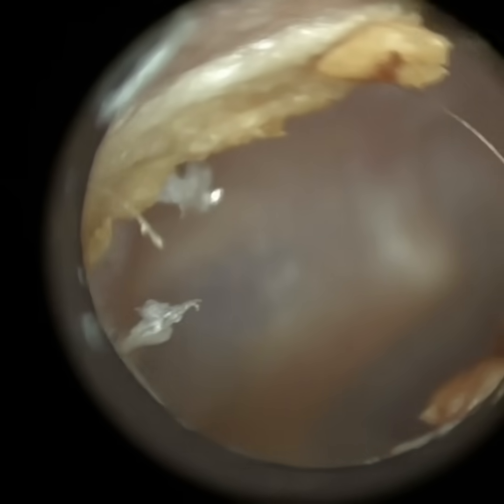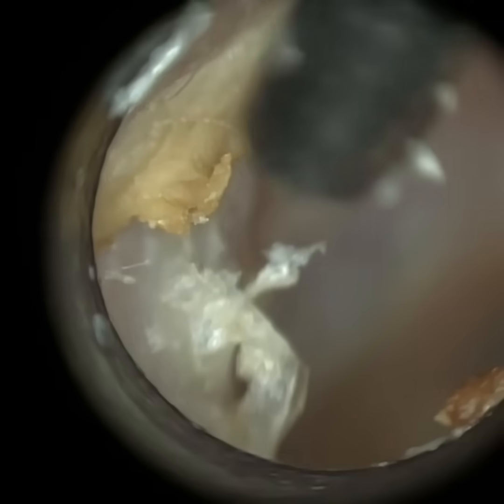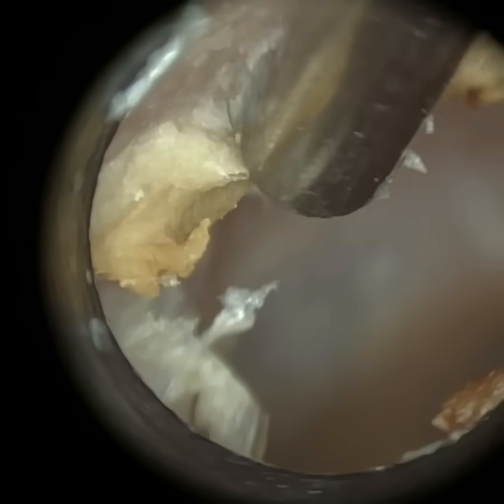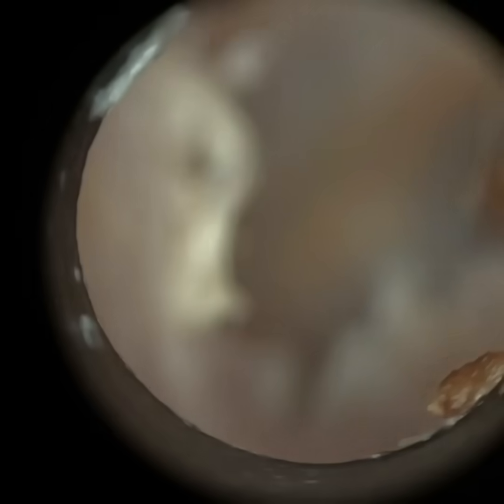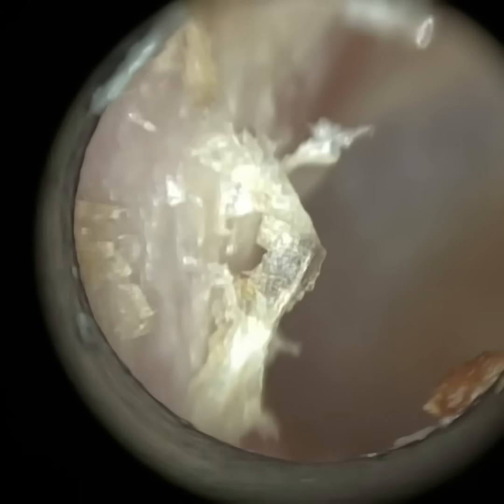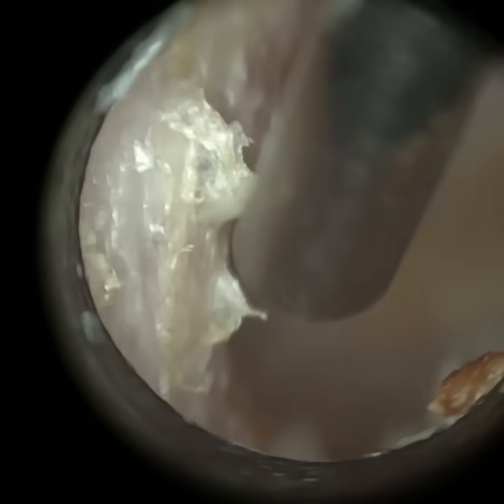When you're using the fine end with dead skin like this, you're also going to minimise clarinetting. Clarinetting is when you suction dead skin and it violently flaps at the tip of the suction probe, emitting a very loud high-frequency squeal which is unpleasant not only for the patient but for myself as well. We did get a bit of clarinetting on the left side — there was some skin I was peeling away near the eardrum, so we left a little bit behind.